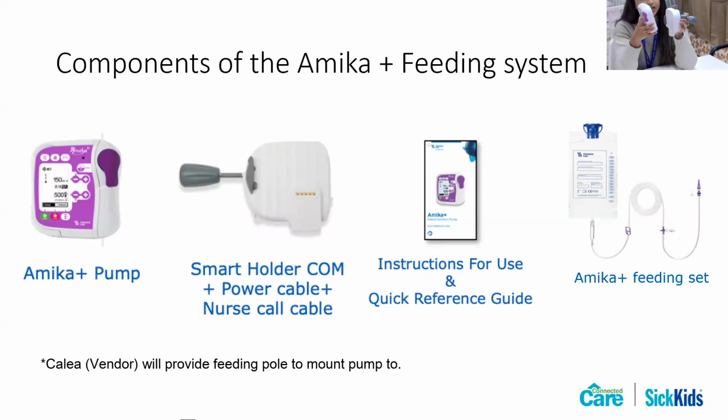And how to dock it is you would slide this into the smart holder until you hear a click. And I'm hoping you heard that click. But there is a click that you would hear, and that really docks it in place. And just to really highlight it, the Amika Plus pump will not charge or gain battery unless it's attached to the smart holder.